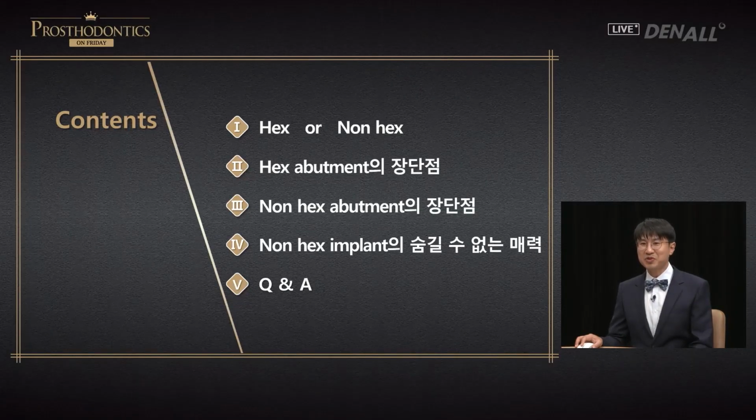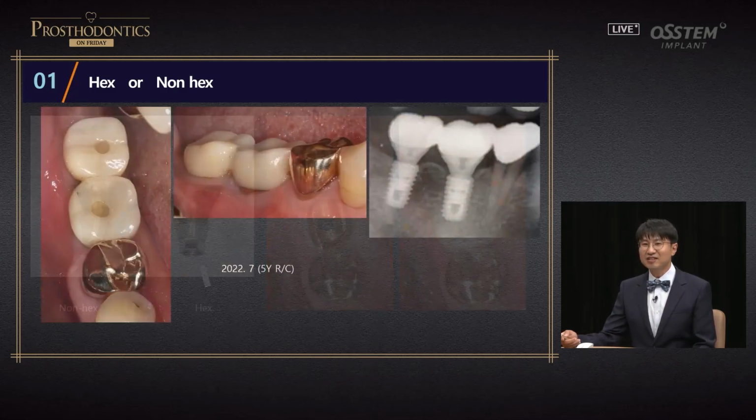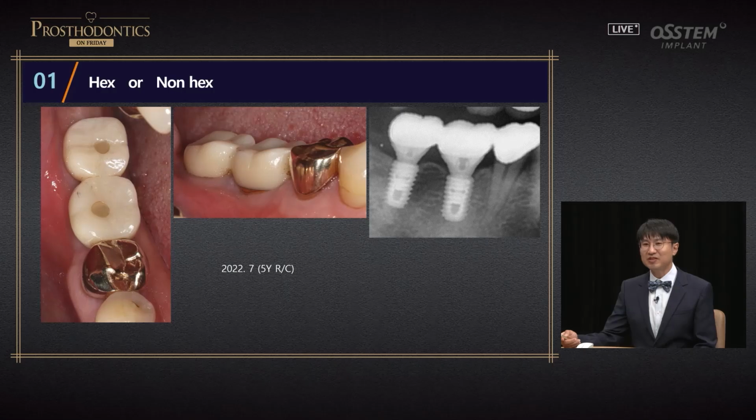Greetings, I'm Dr. Park Jong-hyun. The contents of the day can be divided into 5 as shown. Hex or non-hex? Let's take a look at this first. At one point, I intermixed hex and non-hex products. You cannot really sense the difference depending on hex or non-hex.